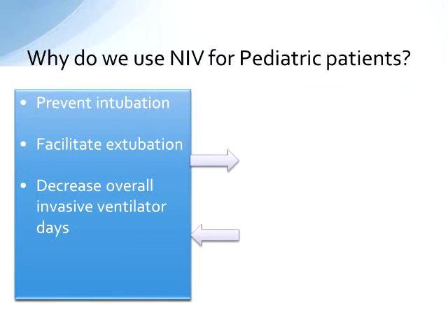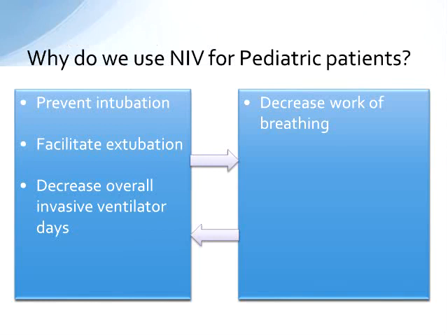The ability to prevent intubation and to facilitate extubation would, in theory at least, decrease overall invasive ventilator days for those patients, and then hopefully, in doing so, decrease overall ICU stay and cost to that patient and the facility. It does that by decreasing work of breathing, so it's offloading some of the work needed by the respiratory muscles, and decreases energy expenditure with each breath, just like any positive pressure ventilation would do.